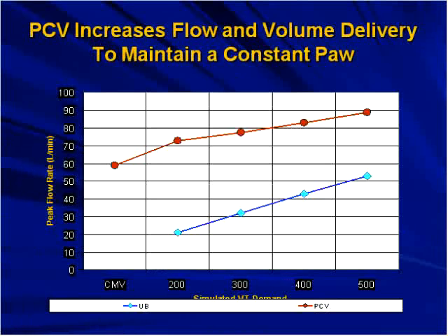So let's talk a little bit about pressure-regulated ventilation. Most people reflexively think that pressure control or pressure support improves work of breathing. Very often it does, but as I'll show you, there are some aspects of that which don't always play out. Now, going back to the lung model setting, this is a quick way to show how pressure modes improve patient work of breathing. And again, this is the spontaneous flow rate from the lung model as the patient was trying to suck in 200 to 500 tidal volumes.